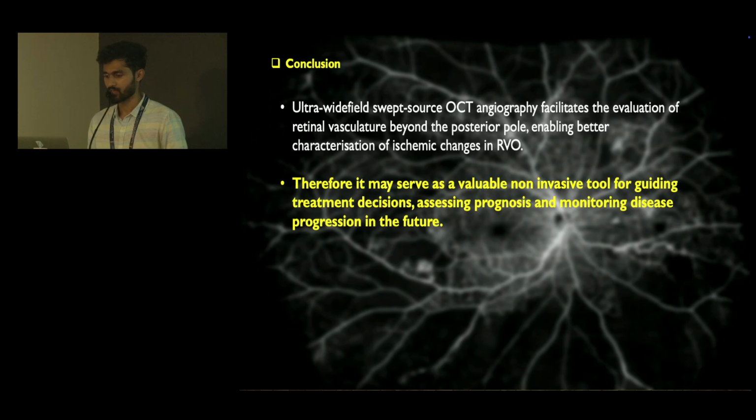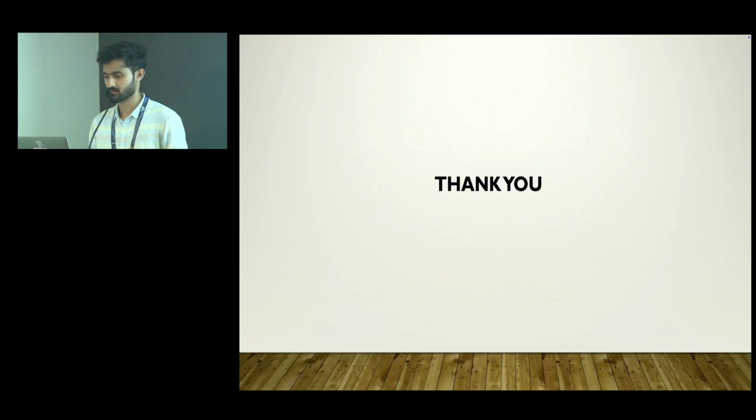So, ultra-widefield swept source OCT angiography facilitates the evaluation of retinal vasculature beyond the posterior pole, enabling better characterization of the ischemic changes in RVO. Therefore, it may serve as a valuable non-invasive tool for guiding treatment decisions, assessing prognosis, and monitoring disease progression in the future. These are my references. Thank you.